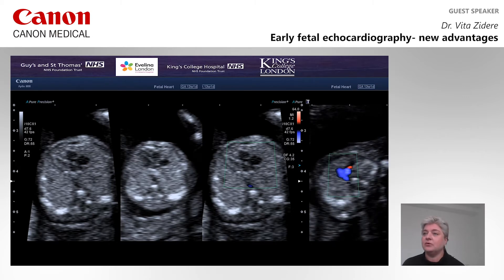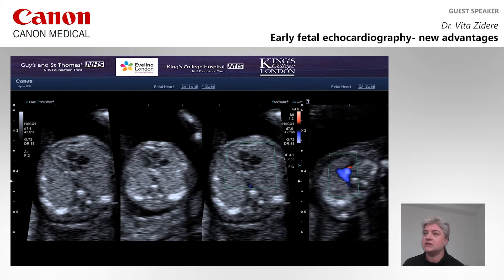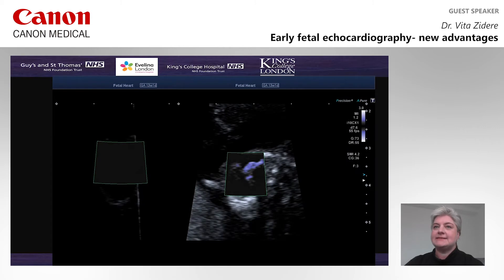So therefore, it is not clear whether the transverse aortic arch is complete. In addition, SMI was used in assessment of this fetal heart.